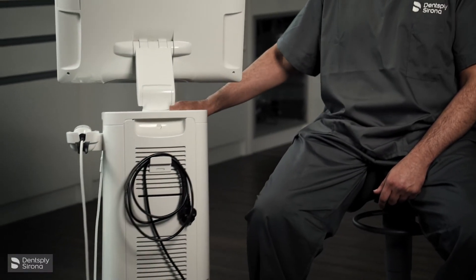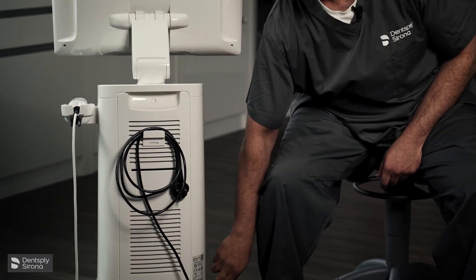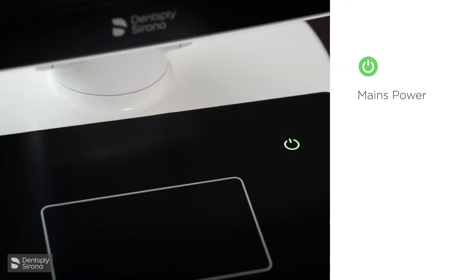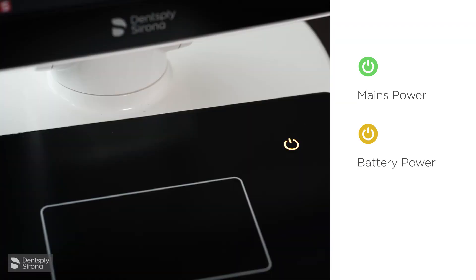At the back we have the mains with a cable tidy, and it's plugged in with an isolator switch at the bottom. The Prime Scan has a traffic light power system. When it's attached to the mains, the light is green. When it's switched on in battery pack mode, the light is orange.